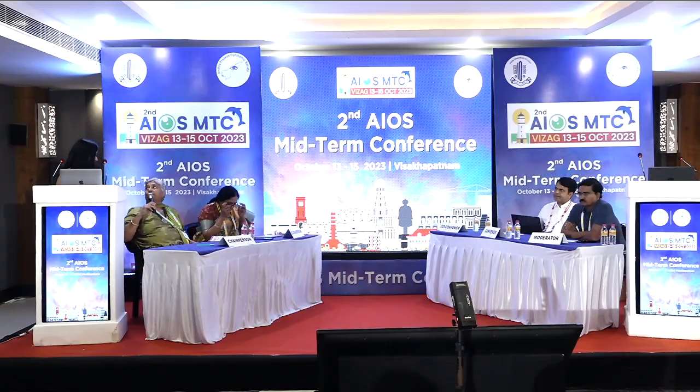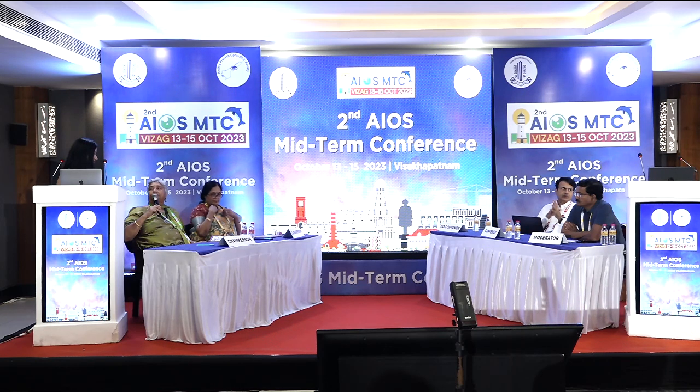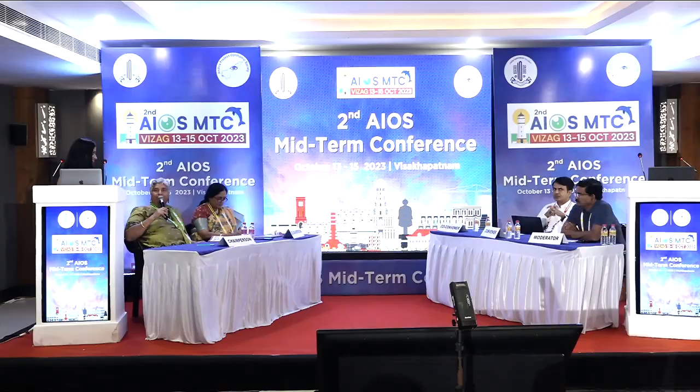And ultrasonography of the orbit also contributes, yes, especially in case of orbital cysticercosis. Yes. So that definitely adds additional value alongside MRI.